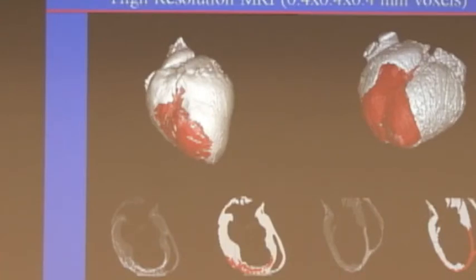Sometimes it's just completely off. There's a little bit of fuzziness in this, and some things are a little bit ambiguous. But I think if you use consistent criteria, it's probably okay. Anyway, we found an intensity-based algorithm that seems to be consistent with what we see on the images.